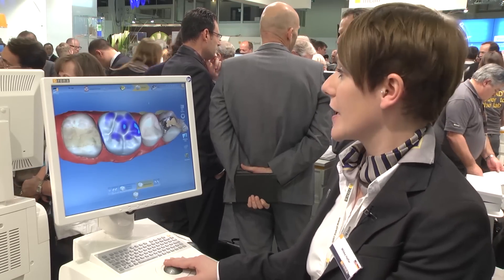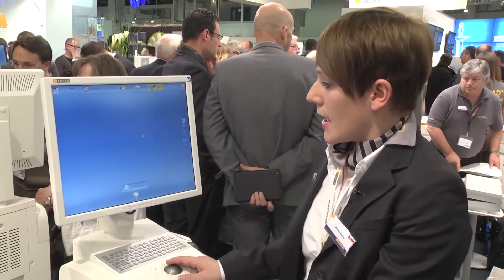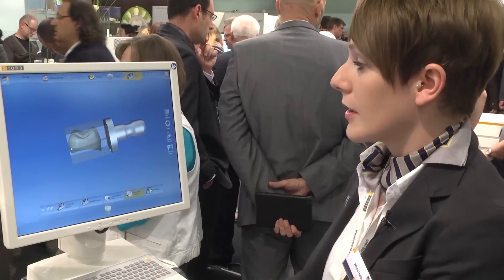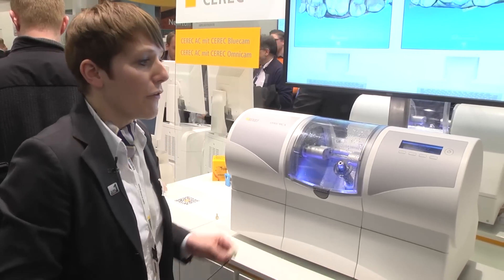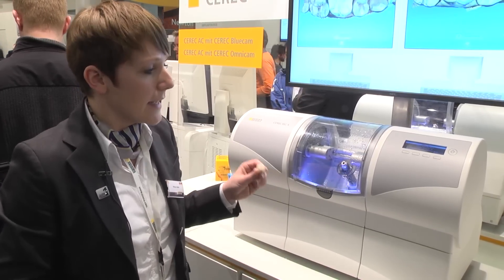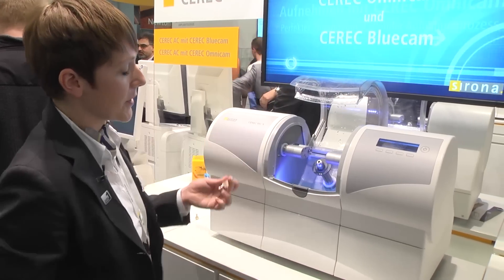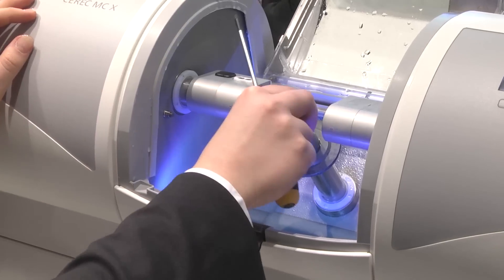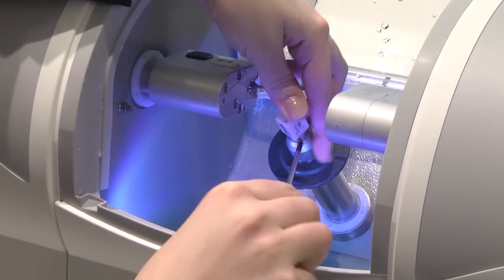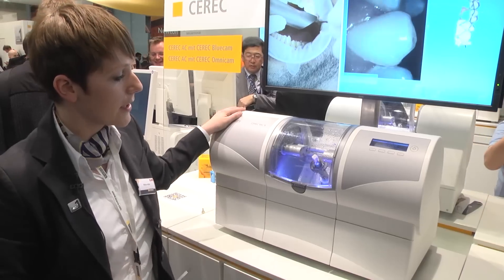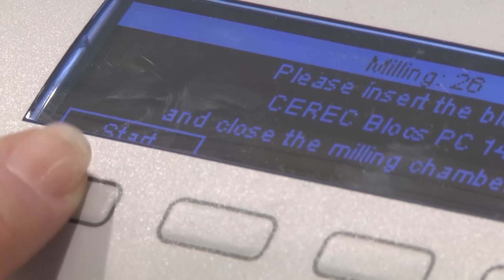That's the final crown, and now we can send it directly to the milling machine. We calculate the mill preview and see the polychrome block already with a crown inside. To start the milling process, we first insert the CEREC block — in this case it's a CEREC block PC, the polychrome one. I open the door, insert the block, and with the screwdriver I secure the block in place, then close the door and start the milling process.